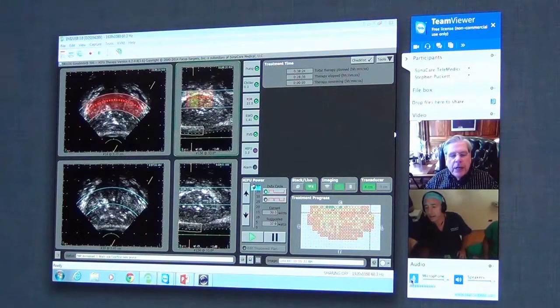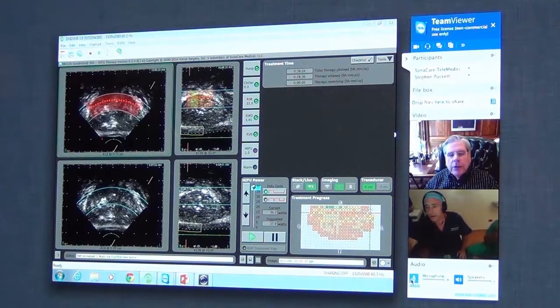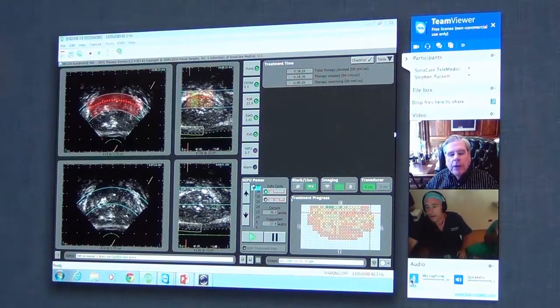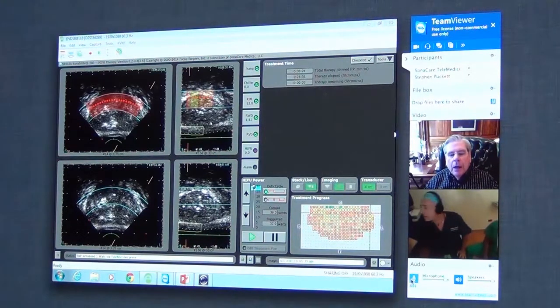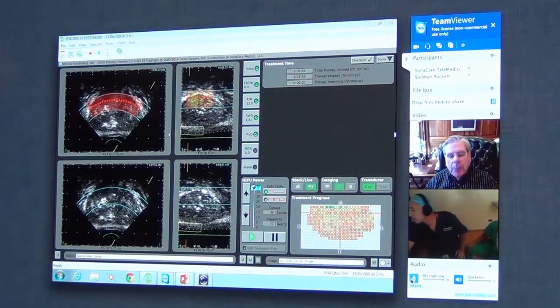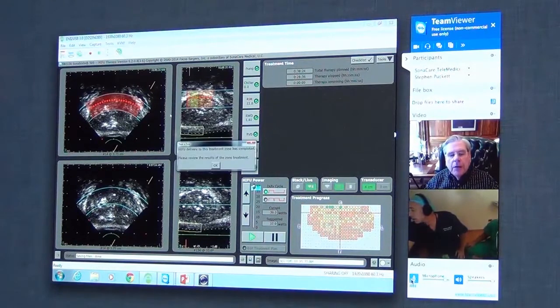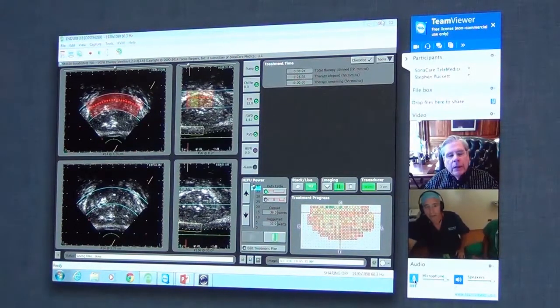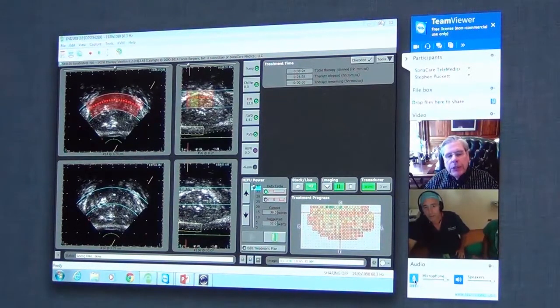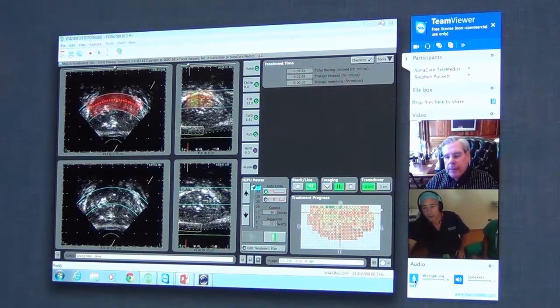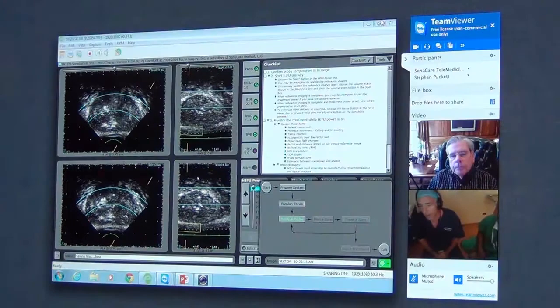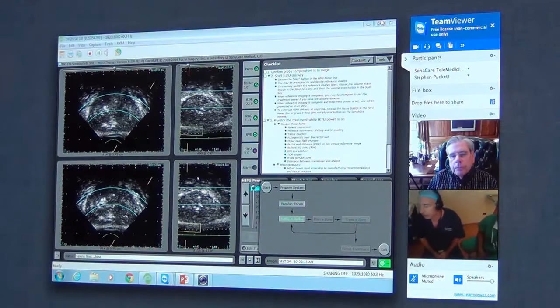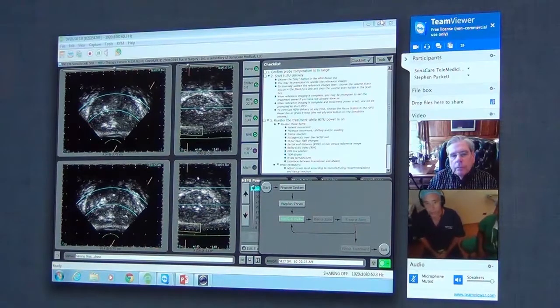We can see the treatment zones. We can see the progress. We can see the entire planning that you've done in the zone and we can see all the controls. Not only can we see it, but it looks like it's completely real-time here in Charlotte.